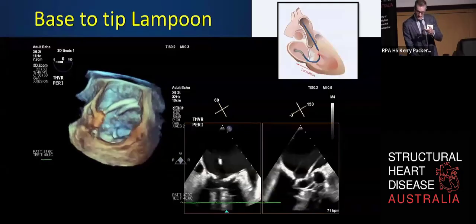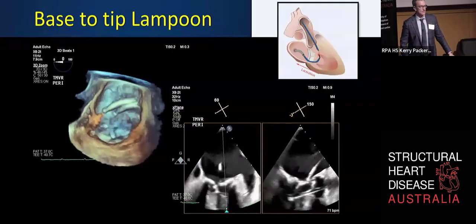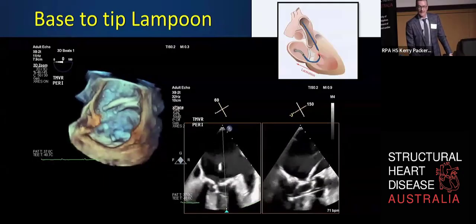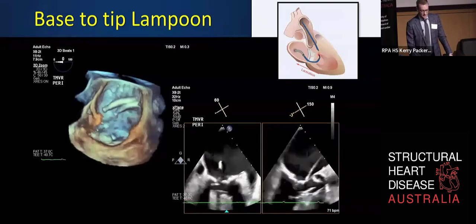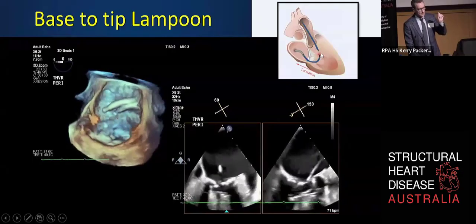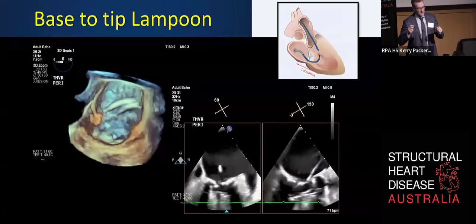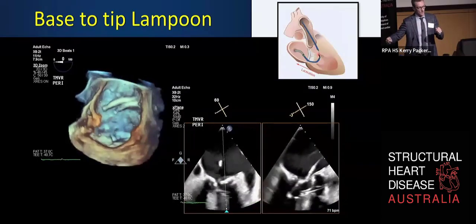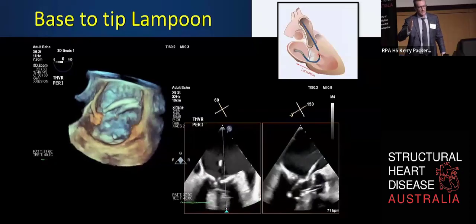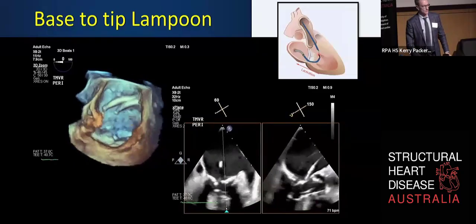So we heard about the hemodynamic consequences of splitting the anterior leaflet. And this is now something that's happening with catheters. So this is a procedure that has a name. It's called the LAMPOON procedure. This is a form of catheter-based electrosurgery. The idea, as the little graphic on the right shows, is you create a rail with a catheter, you denude a little V-shaped part of the catheter, you position it, and with the right timing, outside the body, you electrify the catheter. It has a wire running through it. You electrify the wire, and then as you pull on the electrified wire, it will slice, like cautery, right up the anterior leaflet. So you're sort of opening the curtains before you deploy the valve, so the leaflet doesn't get displaced into the outflow tract.